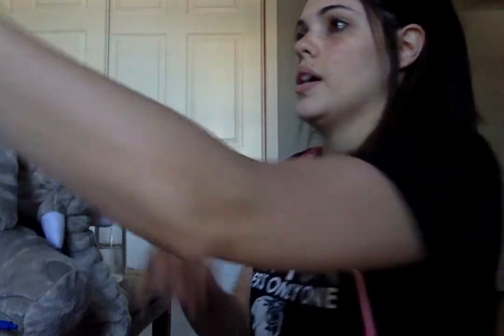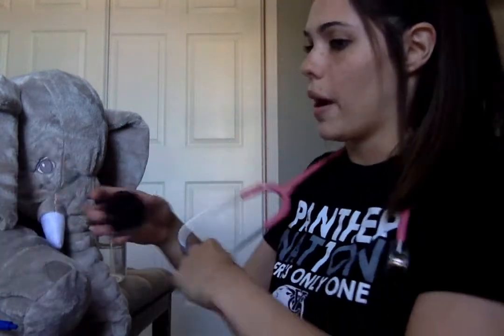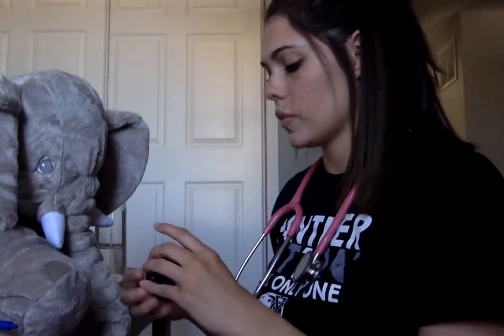Perfect. Alright, and so the next one that we're going to do is a medication called Foradil, which is also known as Formoterol. We're going to do this through a dry powder inhaler. This is the mouthpiece, so you're always going to exhale away from this device. That way you don't get any moisture inside the powder, and it won't be able to work effectively and won't get in your lungs.